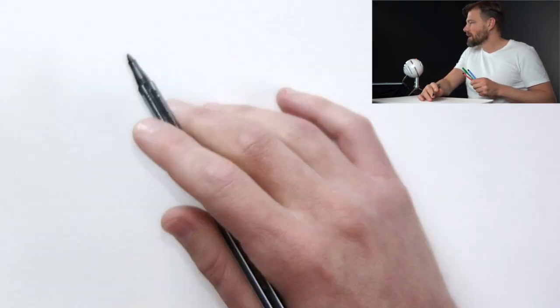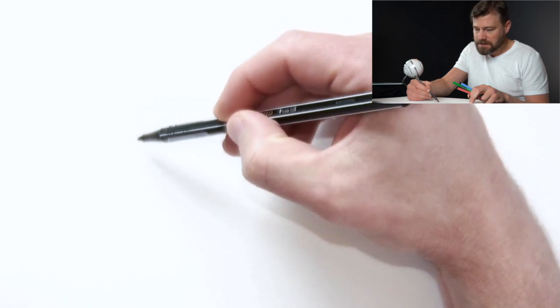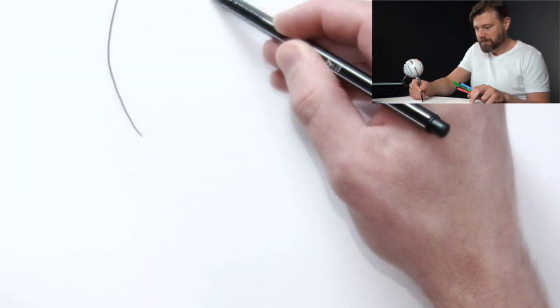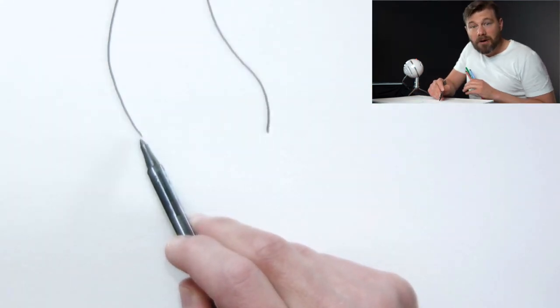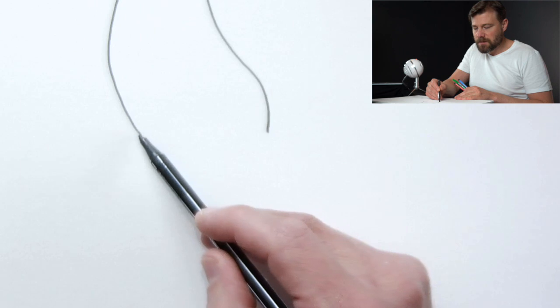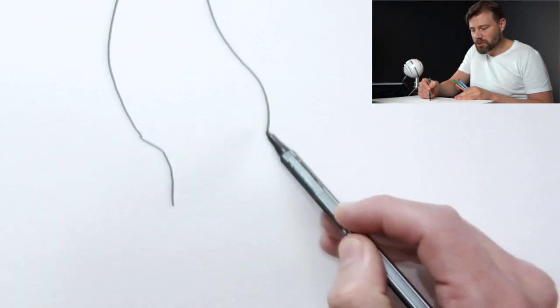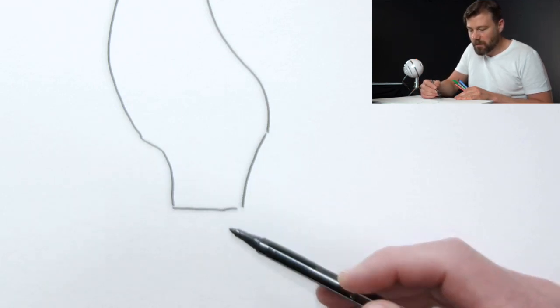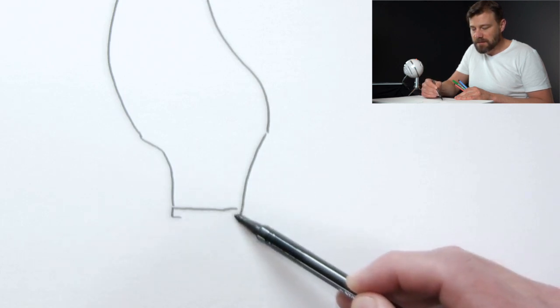When I face a case like this one, usually what we have is the crown here. When I reach the border of the soft tissue, this crown is going to have more or less this kind of contour, okay? It's supposed to be a concave contour until I get to the surface of this abutment.